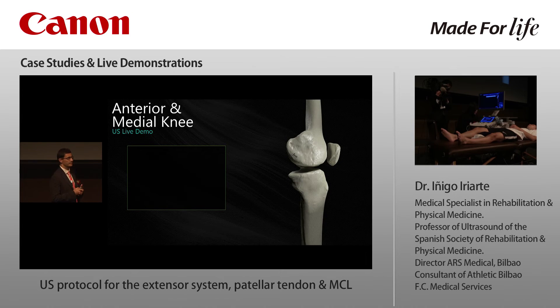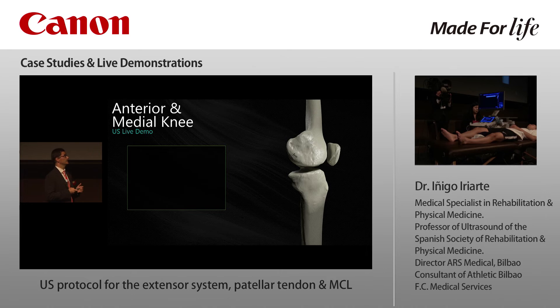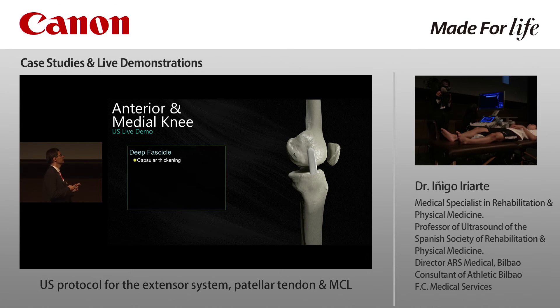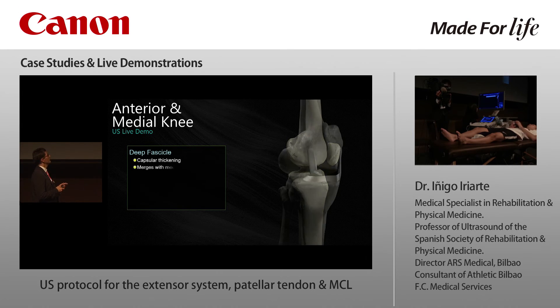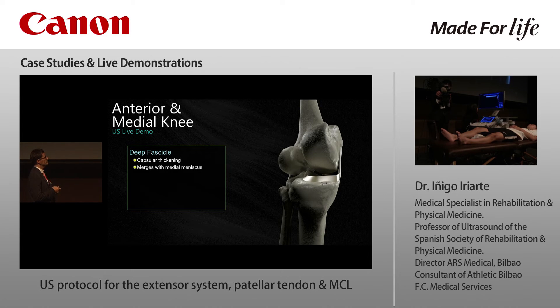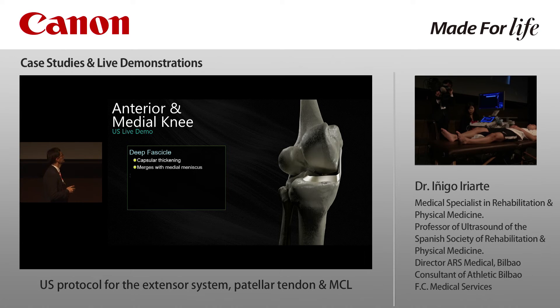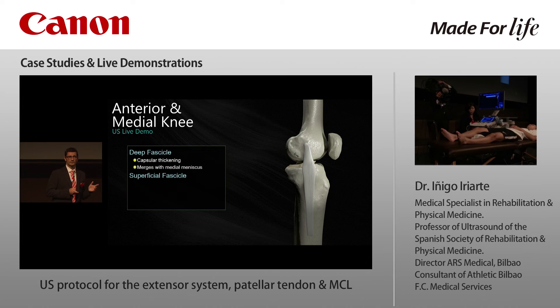Regarding the medial side of the knee, the most important structure when performing ultrasound is the medial collateral ligament. It has two fascicles. The deep fascicle is a small fascicle representing a capsular thickening with a very close relationship with the medial meniscus. It has two components: the meniscofemoral component and the meniscotibial component.